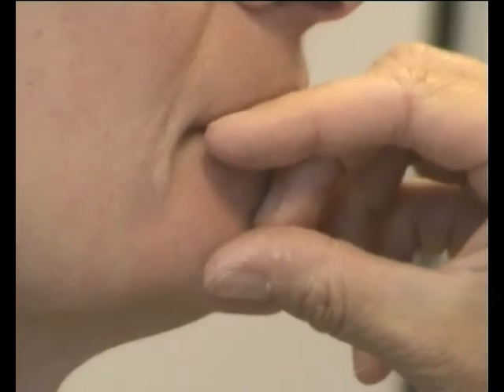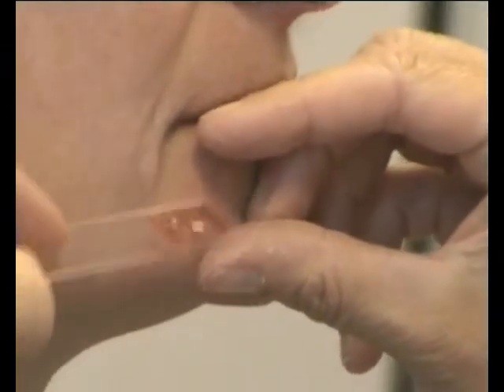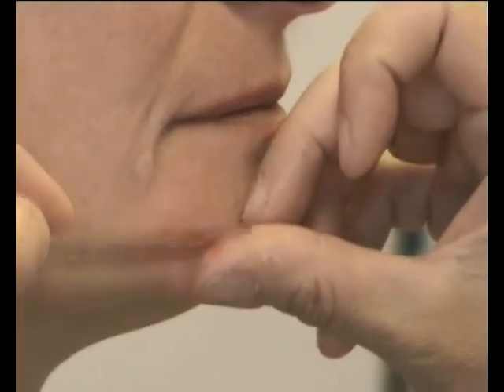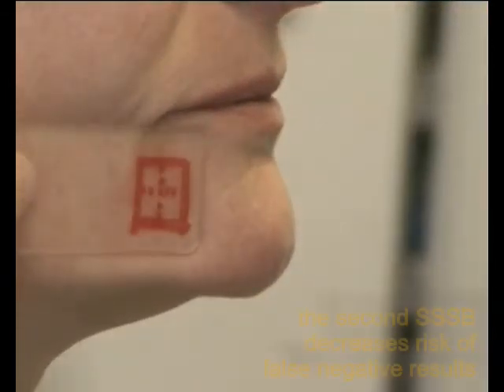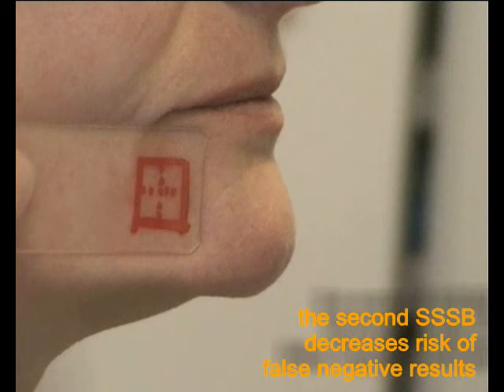Then, on the same place, we put a second identical lamina to get the mites of the deeper layer. It is very useful to prevent a false negative result with only one biopsy.